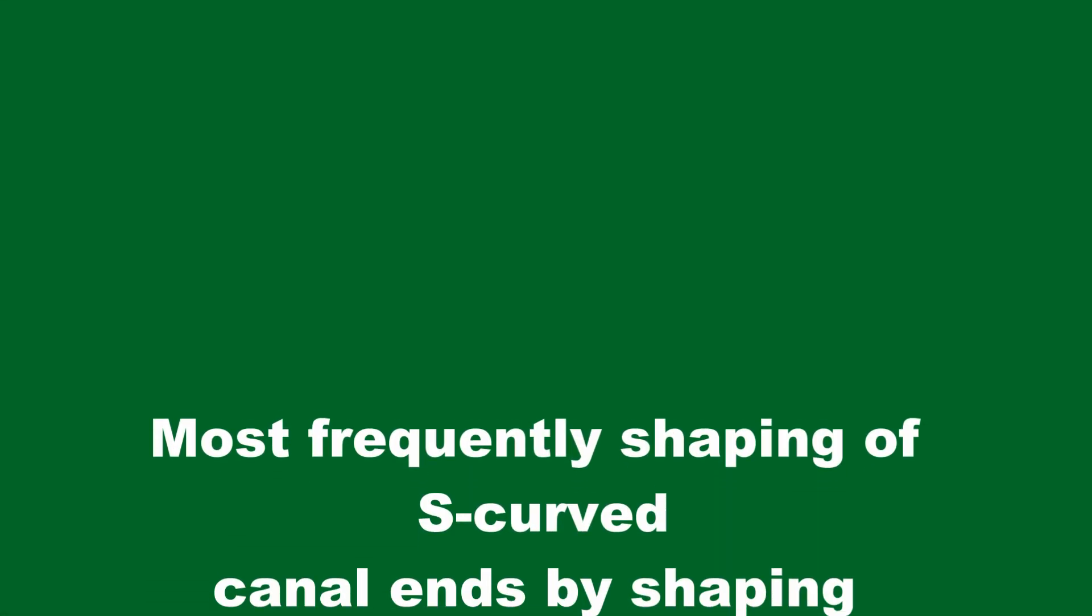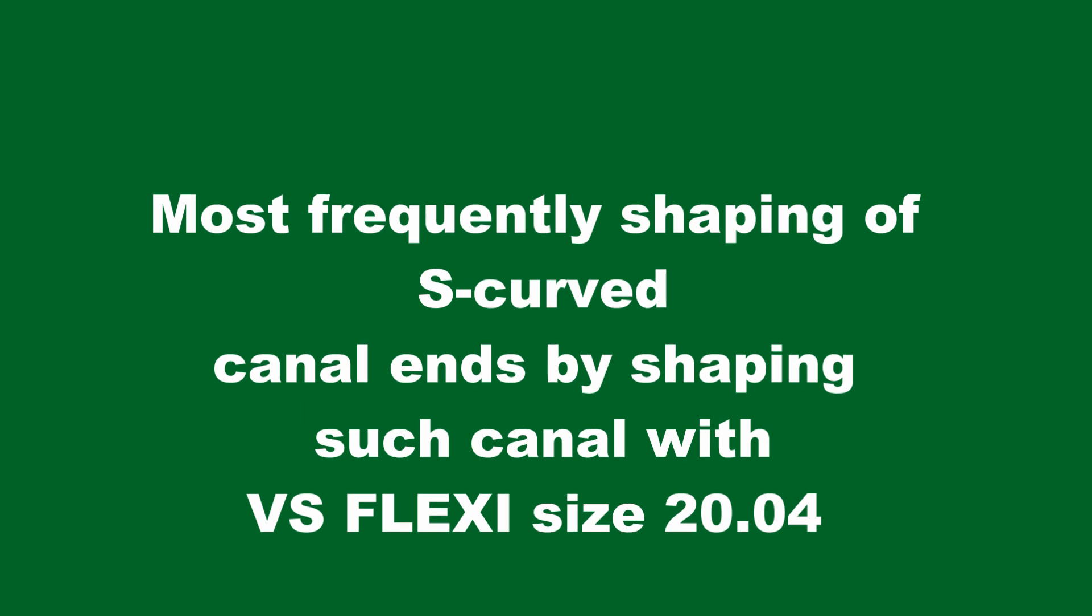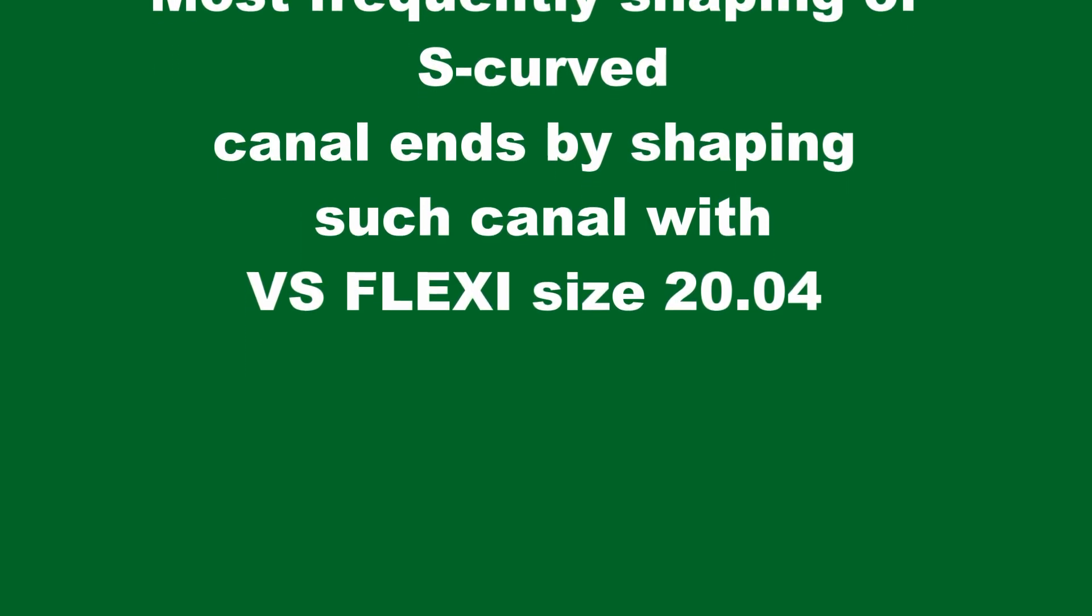Most frequently, shaping of S-curved canal ends by shaping the canal with VS Flexi 20-04.